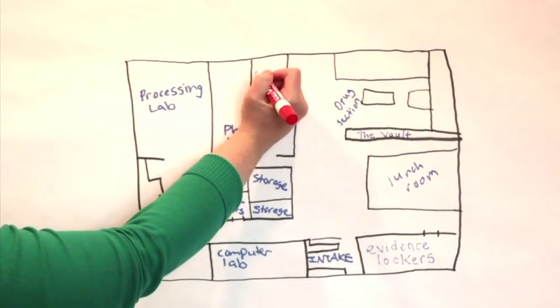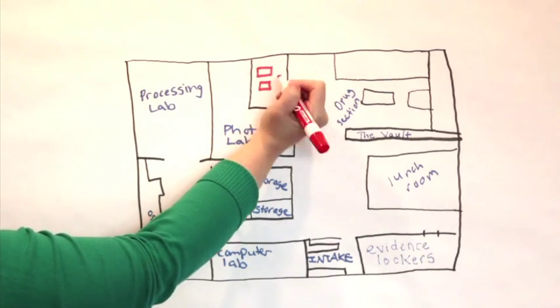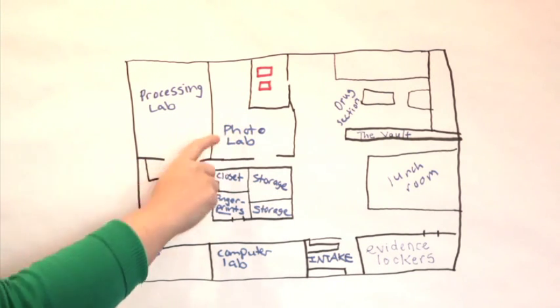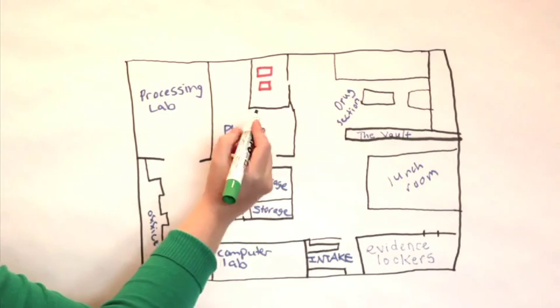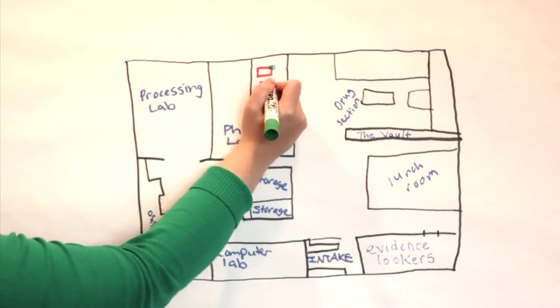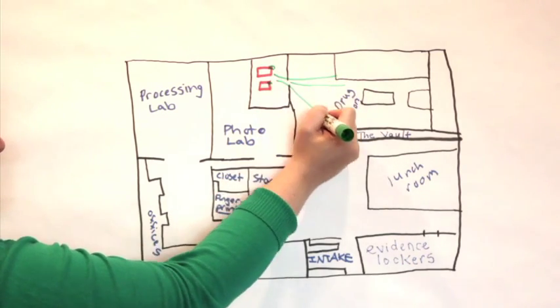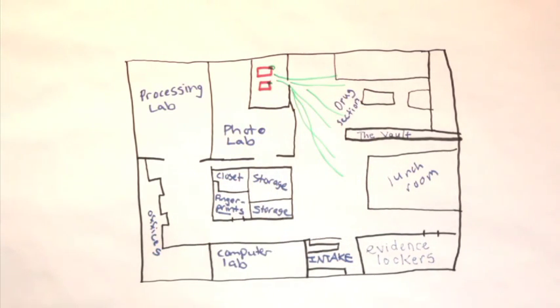Here's why. This is the room where the lab keeps its drug testing machines. The testing process involves putting suspected drugs mixed with chemicals under a lot of heat and a lot of pressure, and that has to ventilate somewhere. Where does it go? The defense says it goes right back into the lab, where it could get mixed with evidence from other cases. That's what attorneys mean when they say the lab could be contaminated.